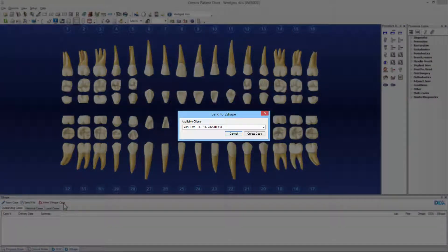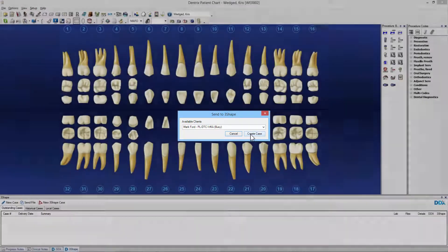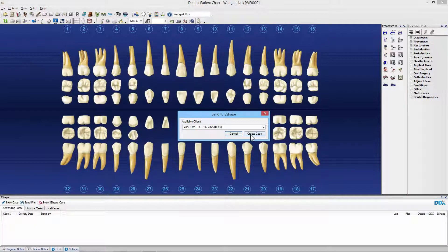Now you need to select the TRIOS scanner PC or cart in the local network. Be aware that the TRIOS application needs to be running on the TRIOS scanner PC or cart in order for it to be available in the list. Press the Create Case button.